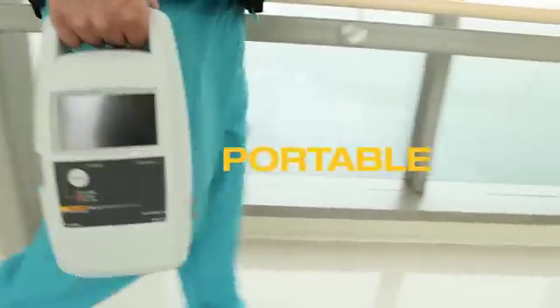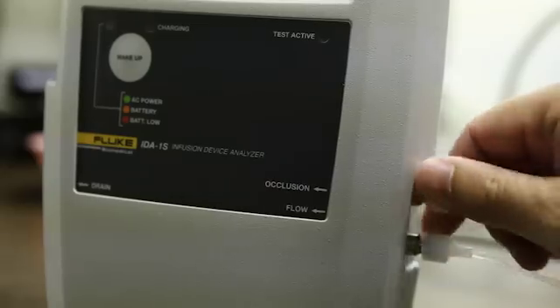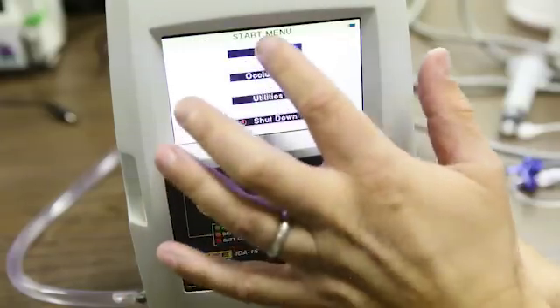We have a bio-mat in our department that goes to different clinics. He has to travel there. He is so excited because he can just take it, do his measurements, and come back. It's simple as that. You have a touch screen — it's really easy to navigate.